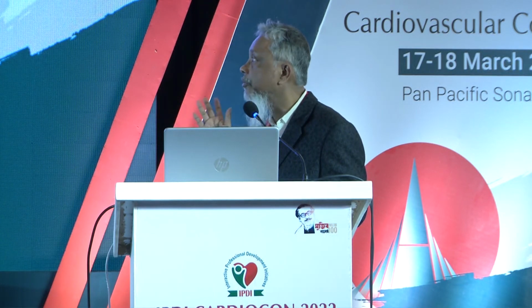Thank you, madam. Absolutely. 3-dimensional right ventricular function measured by 3D echocardiography is the gold standard, we know. It also reflects the uncoupling, the main mechanism which is responsible for right ventricular failure. Absolutely, right ventricular ejection fraction measured by 3-dimensional echocardiography is very authentic. But as regards the RV strain, there is no robust evidence, at least, but at least one study was showing the relation between RV strain and the survival curve.